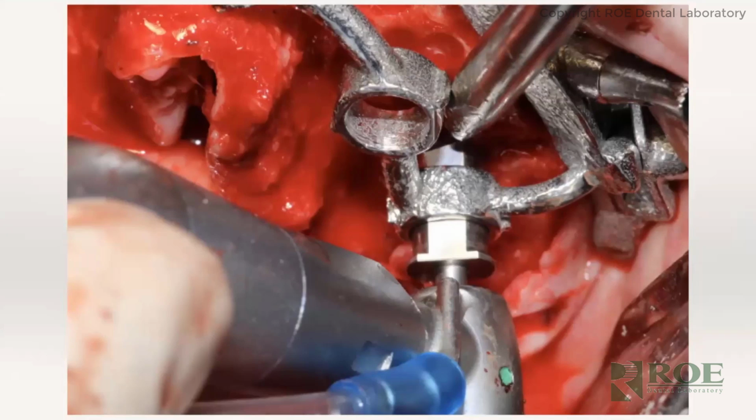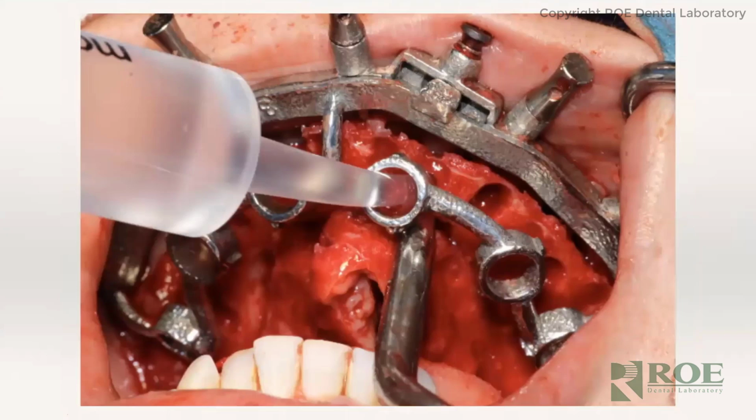Once we have enough of our bone reduced, we'll then place in our osteotomy guide, where we're placing our implants using a barrel system that doesn't require keys or spoons. I always like to rinse out the osteotomy with some saline to clear any debris. I undersize all my maxillary osteotomies, and I will place an implant into the osteotomy if I feel at least one size less than the final osteotomy, sometimes even two, because you're never really sure.